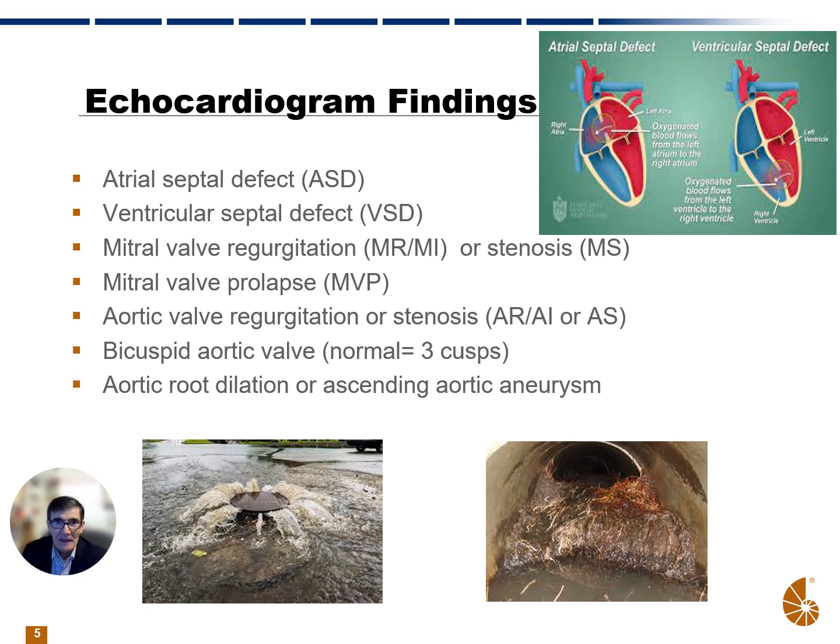So we use an echocardiogram to determine all sorts of findings within the heart.